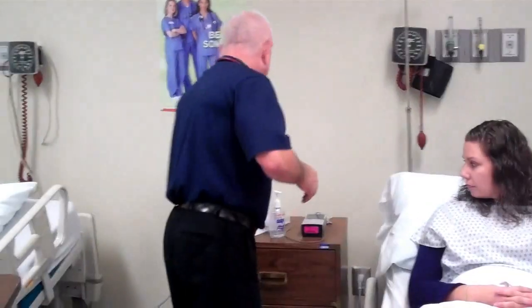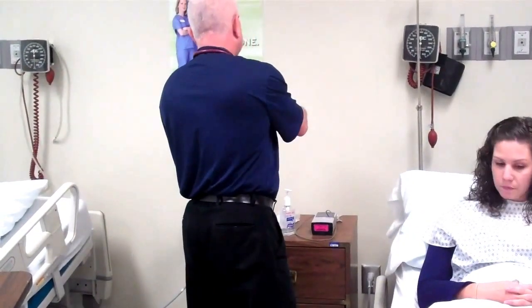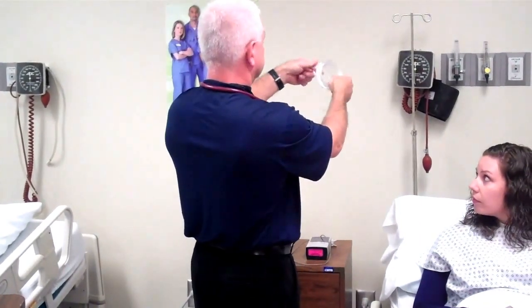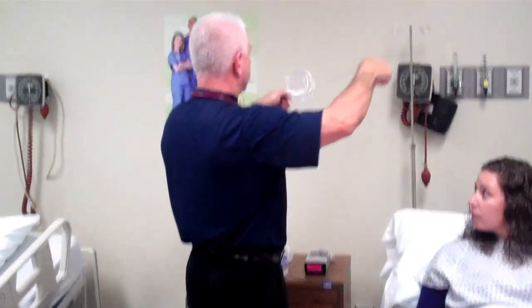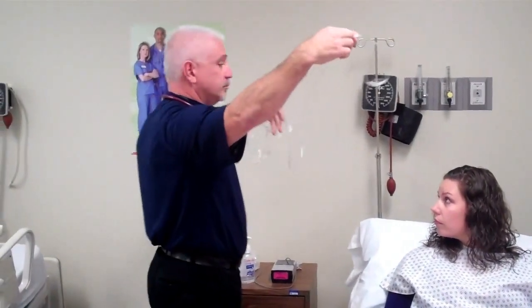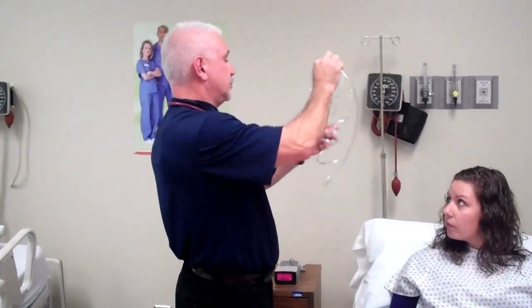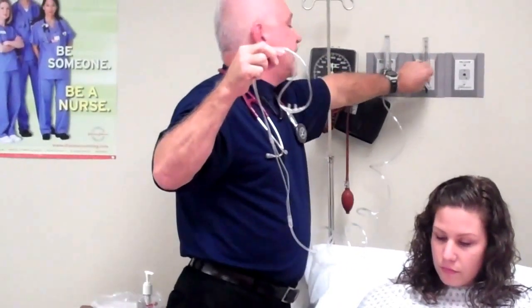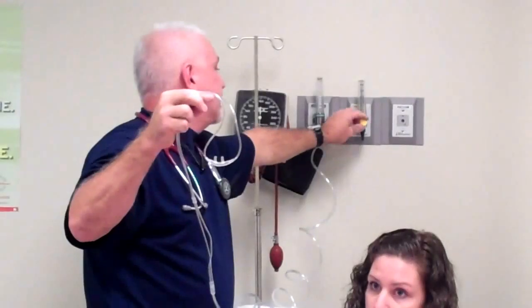So I've got the heart rate, the respiratory rate, sat, I'm looking at her color, and I'm checking her level of dyspnea, which she said was fine. At this point, I will go ahead and set up my equipment, which is the nasal cannula. I'd make sure my flow meter was hooked up into the wall. And now I'm going to use air because we're in a room that only has piped in air.